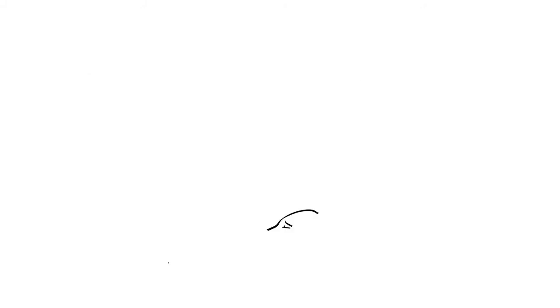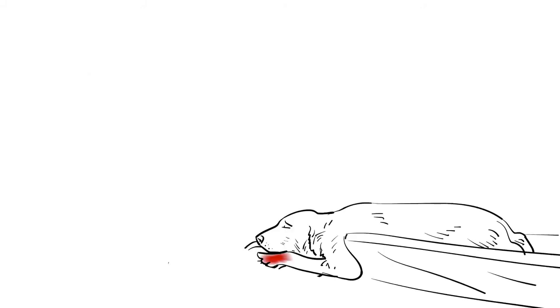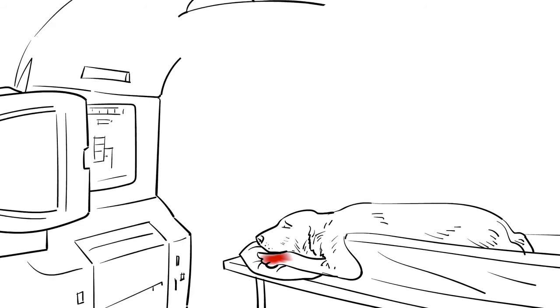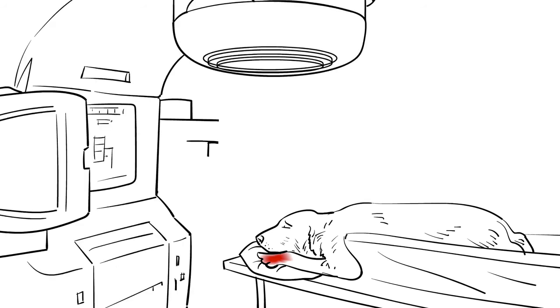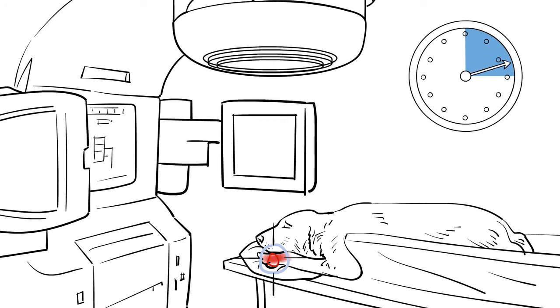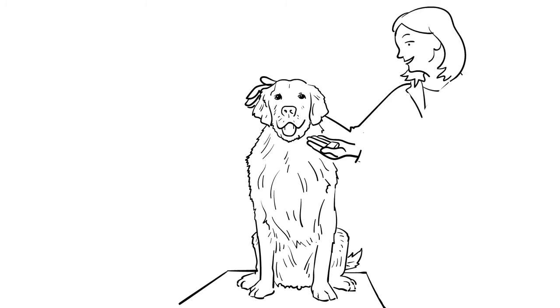The treatment is simple. After a 3D plan of the tumor is prepared, your pet lies anesthetized in a custom-made foam immobilizer, and the radiation dose is rapidly delivered in just minutes. Your pet is then awakened and ready to go home.